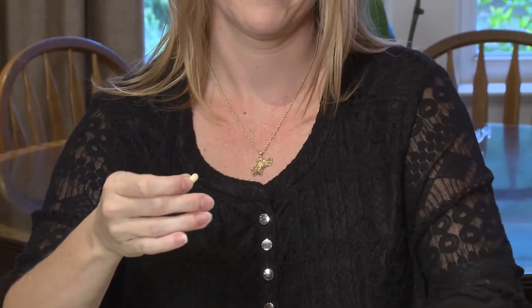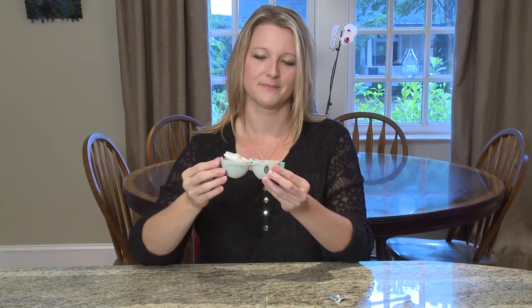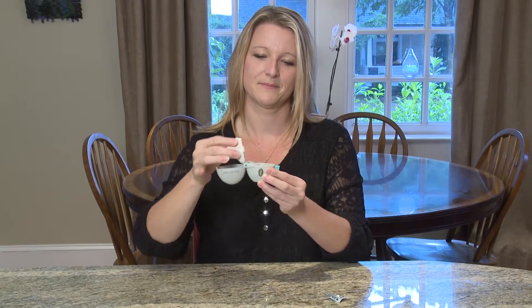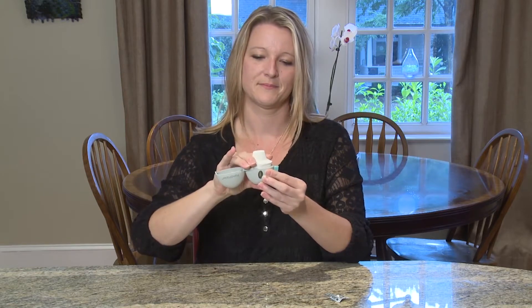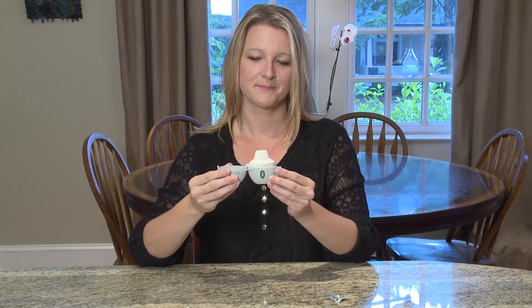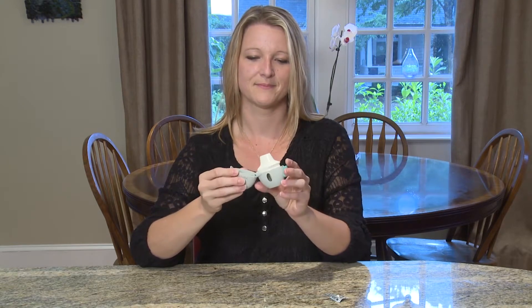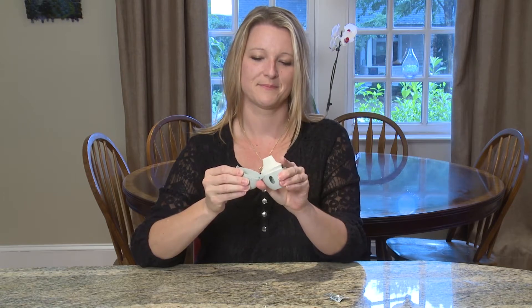Once the mouthpiece has been opened, drop the capsule into the capsule chamber. It doesn't matter which way the capsule is dropped into the chamber. Close the mouthpiece firmly until you hear a click. When the mouthpiece has been closed, press the piercing button on the side once. This will put holes into the capsule so that you can breathe in the medicine.